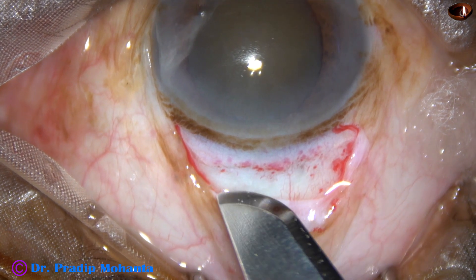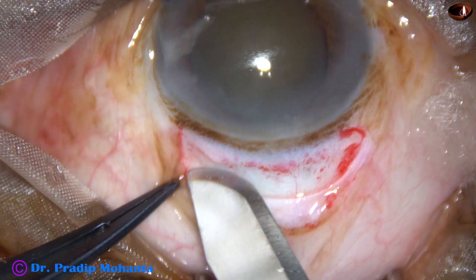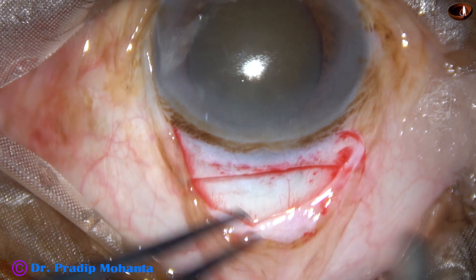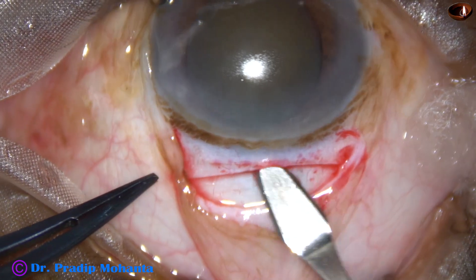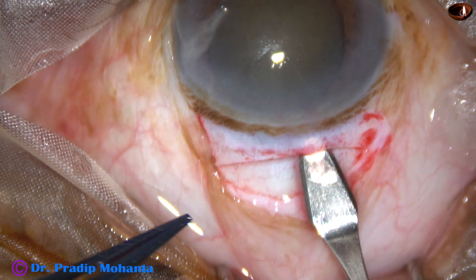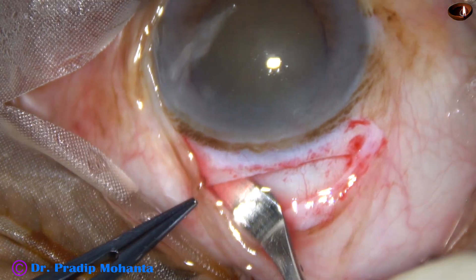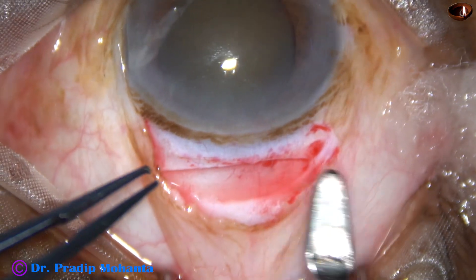Now we have to place the main incision — the incision for the main wound of about 7.5 to 8 mm. This is an almost straight incision, about 1.5 mm behind the limbus, and I have started making the tunnel. The crescent blade goes about 1.5 mm into the clear cornea and is swept from forward to backward in this way. More than half of the tunnel has been done, and now this is the other part on the right side.